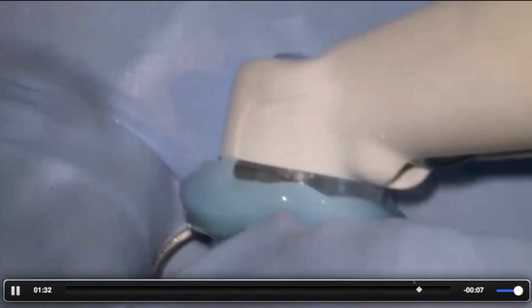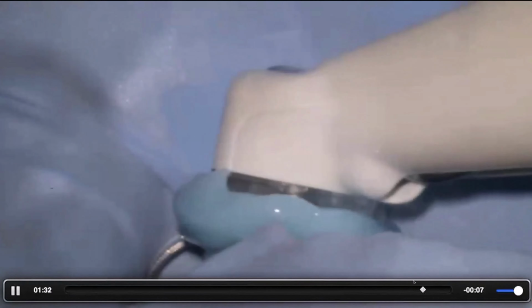I'll just fast forward that, same little modification, and then we can start running Gentlewave, and you'll have a good seal. You can see the line there.